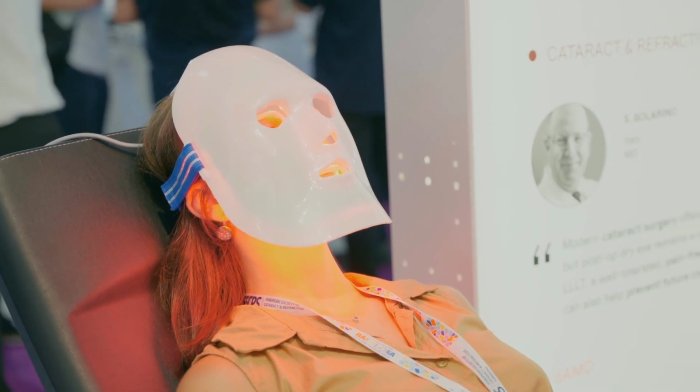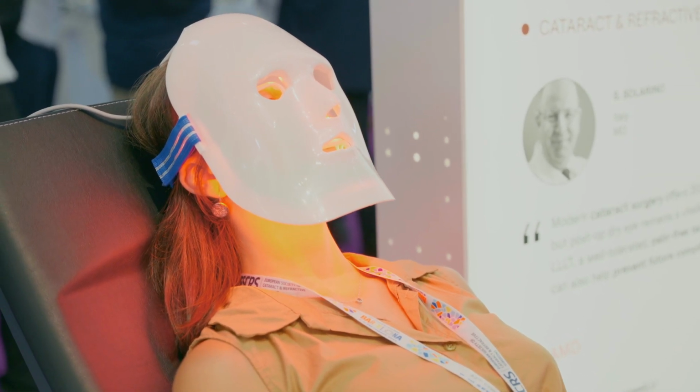So this trial that we're doing is a randomized control trial, which means that the investigator is masked to which treatment the patient's been given. And what we're looking at is what the patients are feeling. So the idea is for us to treat with different types of light, red, blue, and sham, which means a control arm. And then we assess all of those parameters before treatment. And then we'll see when we finish the 30 patients, we'll see what the outcomes are.